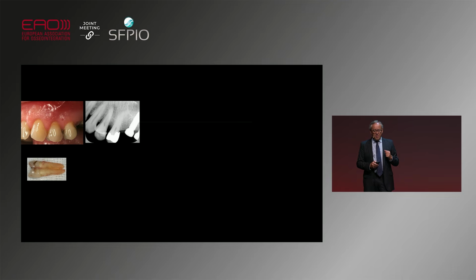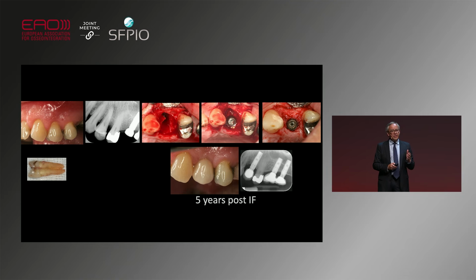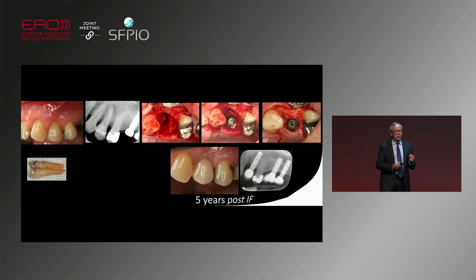So even in situations that I have a huge amount of gap, here the gap was about 5 millimeters, and we allowed it to heal undisturbed. And what happened? The gap was filled with bone. And then you see this is the 5-year post.